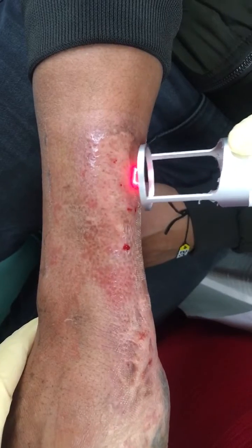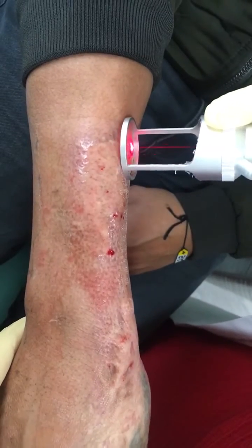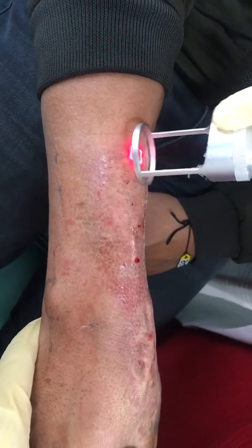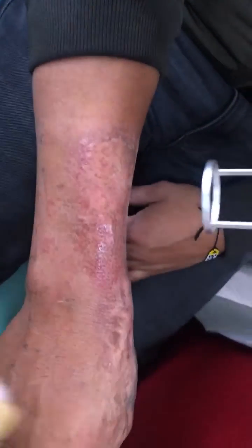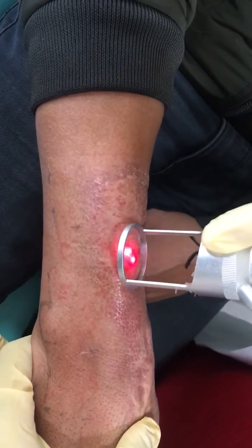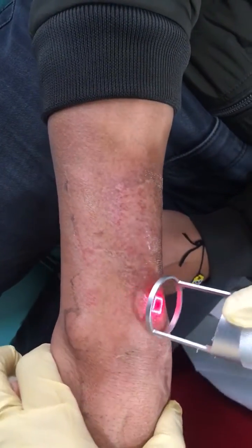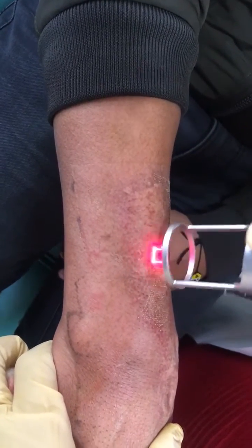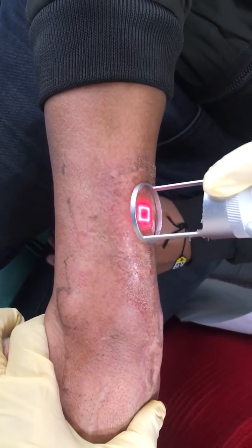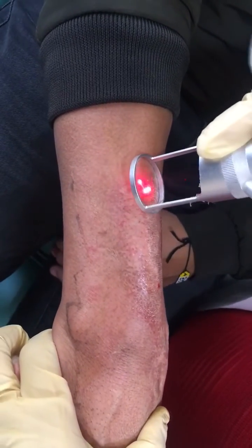Now I'm coming on to the hypertrophic scar area where we have done the mesotherapy. As you can clearly see the stamping pattern of the CO2 laser.